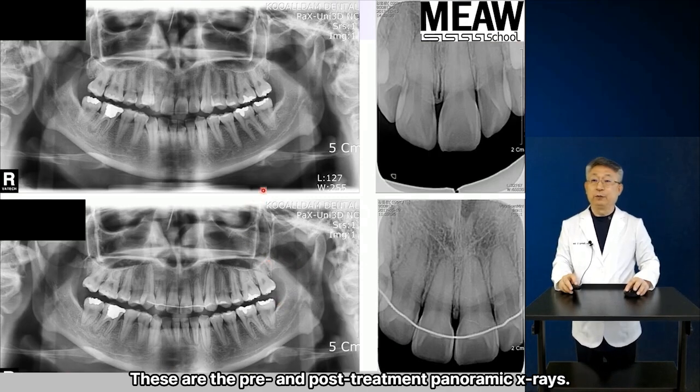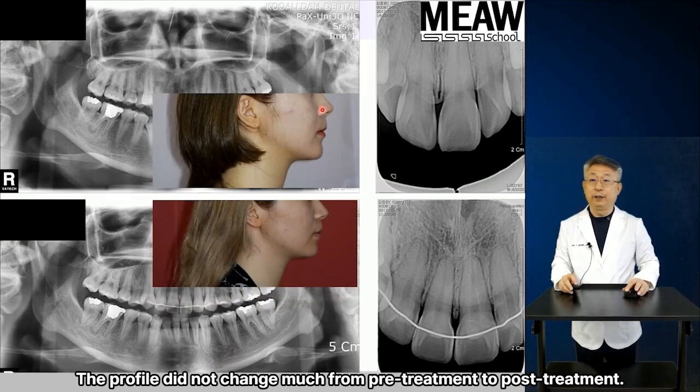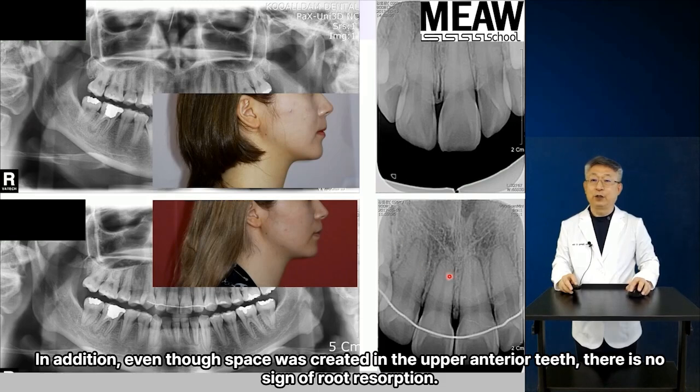These are the pre- and post-treatment panoramic X-rays. The profile did not change much from pre-treatment to post-treatment. In addition, even though space was created in the upper anterior teeth, there is no sign of root resorption.